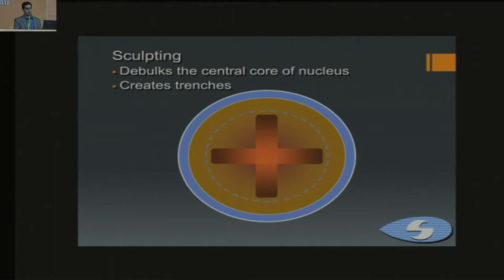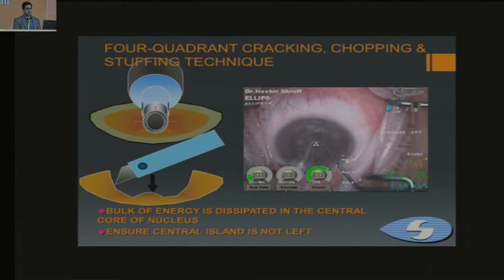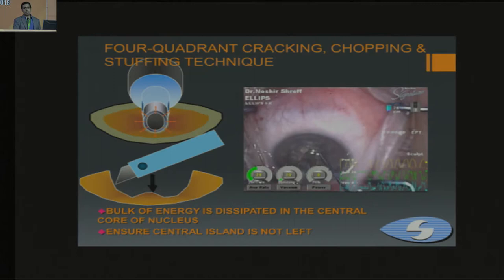This video demonstrates the technique on a fairly black cataract. This approach protects the endothelium — with another technique, the energy would be delivered more anteriorly near the endothelium. As you can see, the trench is being made deep enough. To assess the depth: in a softer cataract, the red reflex becomes brighter, but in harder cataracts you look at the orientation of the fibers.